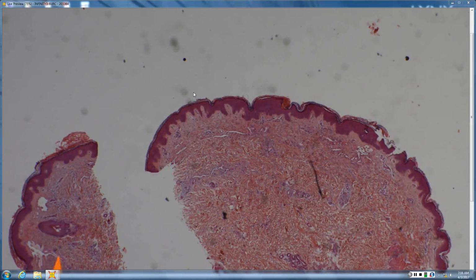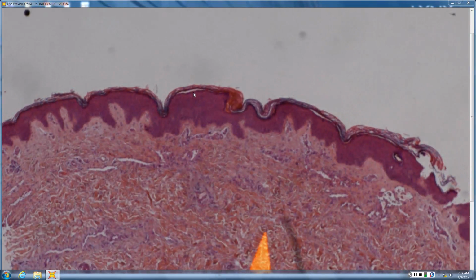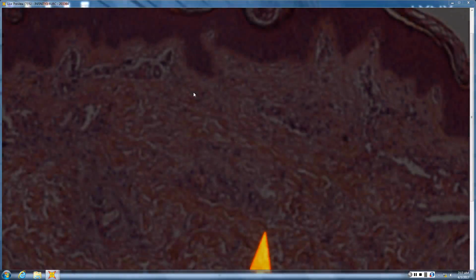Maybe over here is where you're seeing this central, larger vascular structure, large being relative here. And then at the periphery, you get these thin, small, almost capillary-like, slit-like vascular spaces. And when you look closer, ideally you see some hobnailing of the endothelium, hence the name.